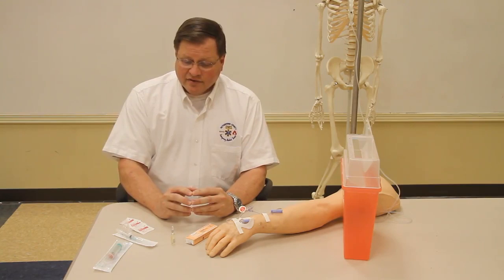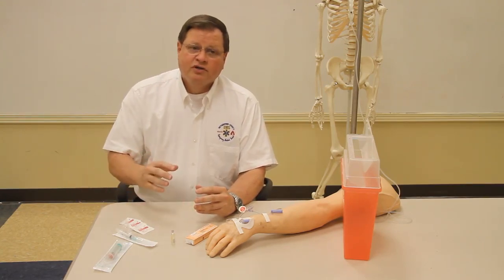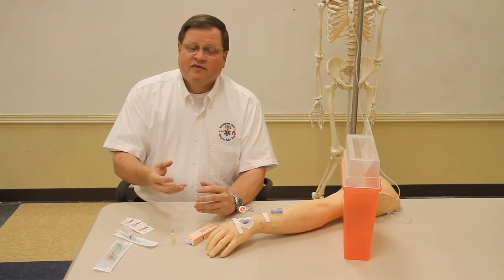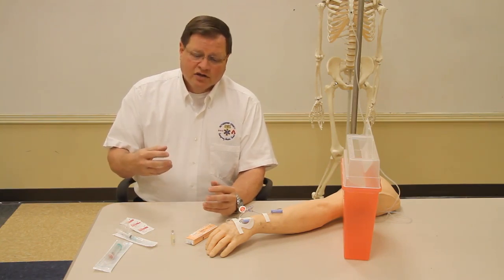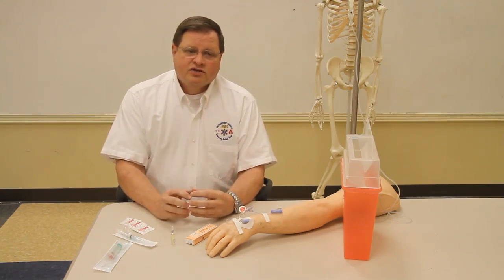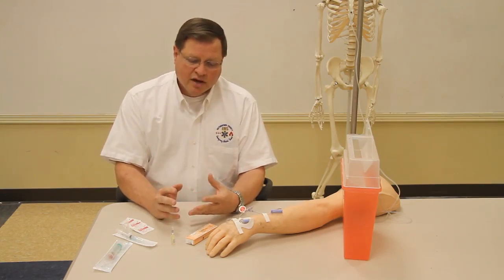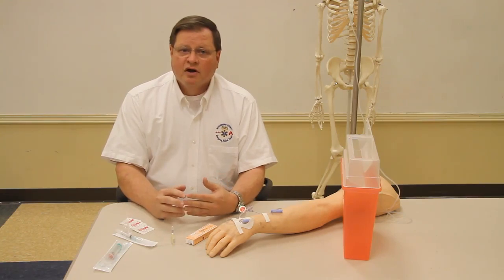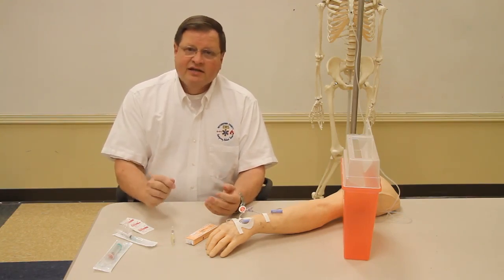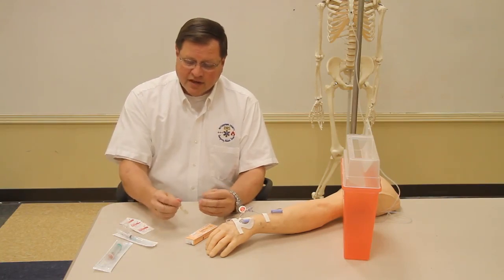In saying that, after you decide that you're going to use the Narcan, we want to get a good set of vital signs, a baseline set of vital signs, and we also want to get a good history if that's available to us. And so making sure that we're suspecting some type of narcotic overdose and they have respiratory compromise, then is when we want to use this drug.